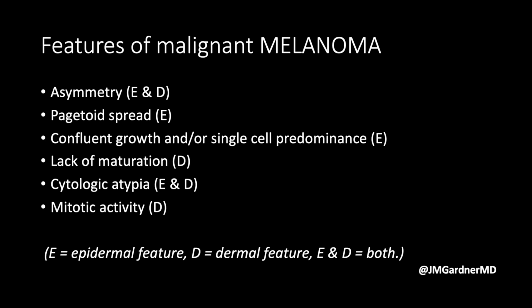All right, finally, melanocytic neoplasms. I'm going to try to get this done without going over. So let's talk about the basic features that you should see. We could talk about nevi and melanoma for days and days, but these are some features that are warning signs for melanoma. None of them are by themselves totally 100% definitive of melanoma, but I'm going to show you some classic examples so that you can know.